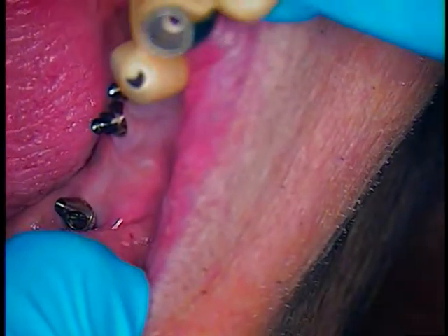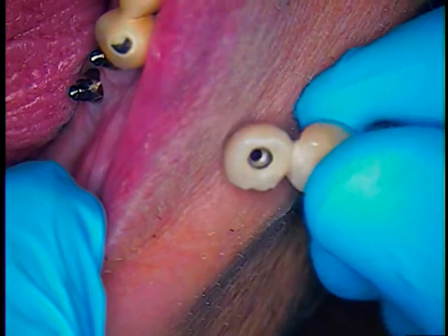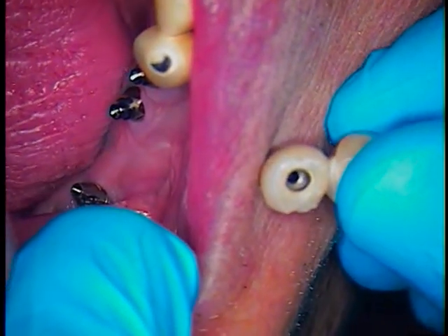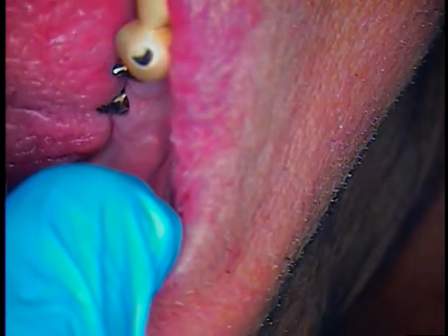So that's the back abutment. There's a little bit of an angle issue here. It looks like we've got to turn it more mesially. I'll loosen it, turn it, and then retighten it.